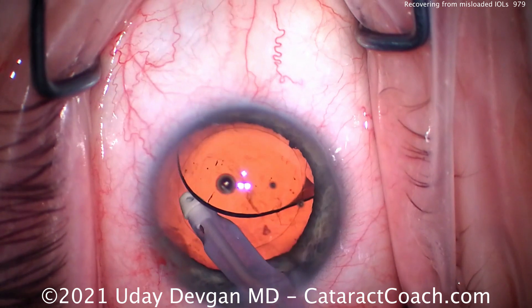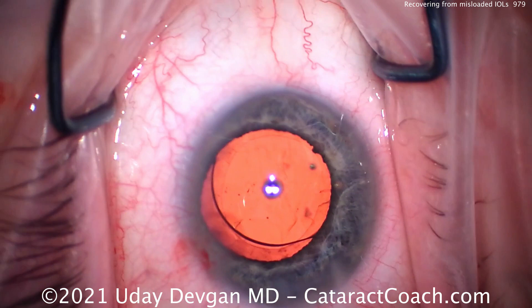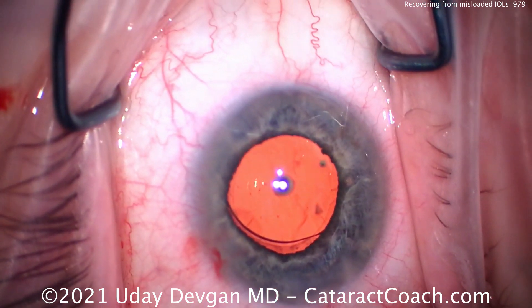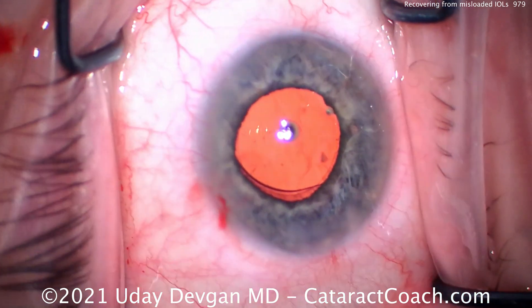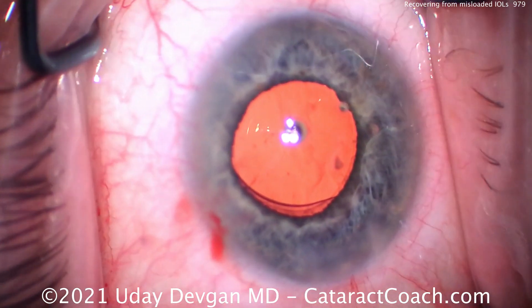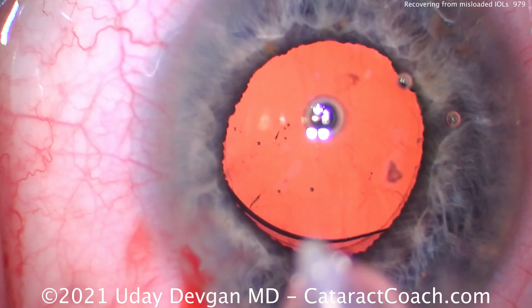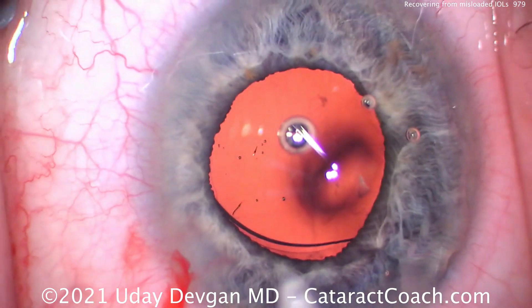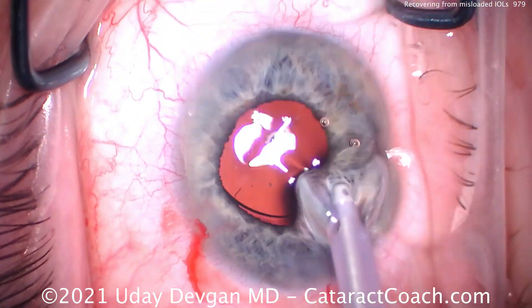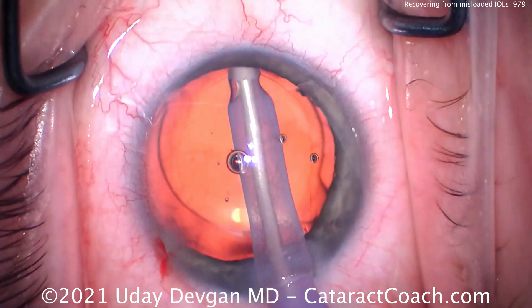Making sure we get it all out. I'm looking at the optic very carefully, and you can see there are some tiny stress fractures on the optic material from compression in the injector. Let's zoom in here and take a look at that. These are very tiny, outside the visual axis, and it won't have a negative effect on the patient's vision.